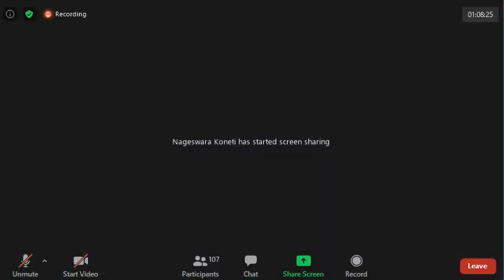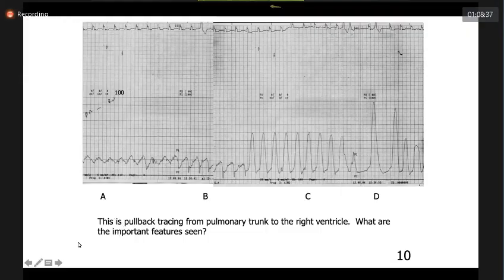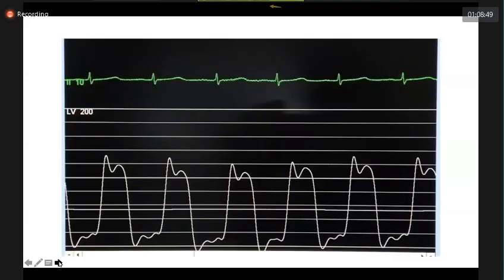Hypertrophic cardiomyopathy. So again, there is an ectopy which is not transmitted and post-ectopy potentiation. So there is an infundibular stenosis also here after the valvulotomy. So this is the normal left ventricle, left atrial pressures, how you record it in 40 scale to compare whether there is a mitral stenosis or not.